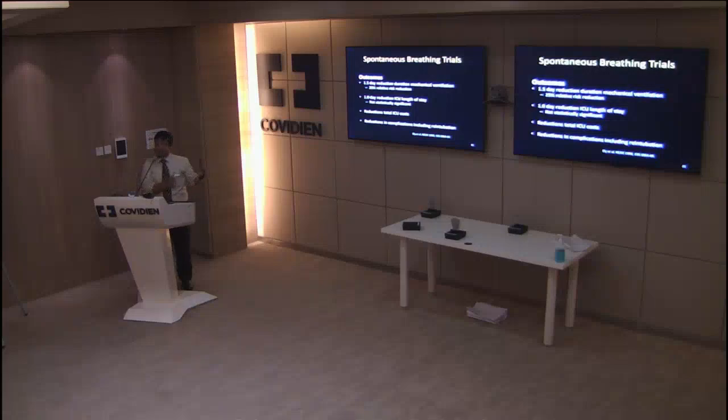So we just heard from Dr. Hegde again, and I'm going back to him, that SIMV is a poor mode for weaning or ventilating, because you're allowing the patient to actually work harder. And all of us, from my generation at least, have grown up using SIMV mode because we were taught that mode. I'm basically an anesthetist. I was taught that mode to use in theaters, and then I carried forward that mode for a few years in intensive care before I realized that mode has become obsolete. It's really not necessary to use SIMV.